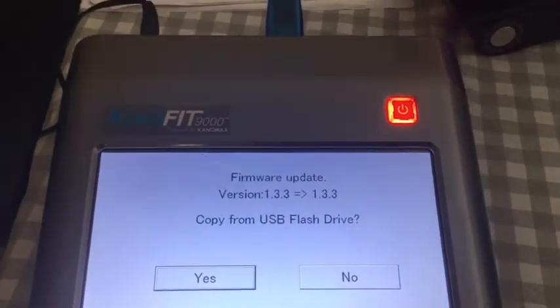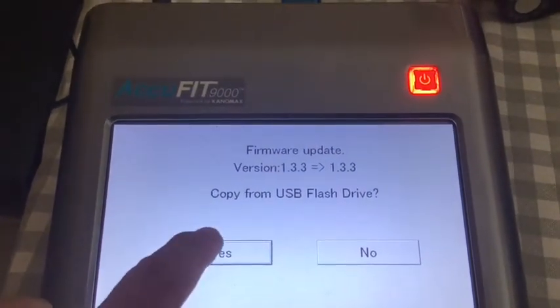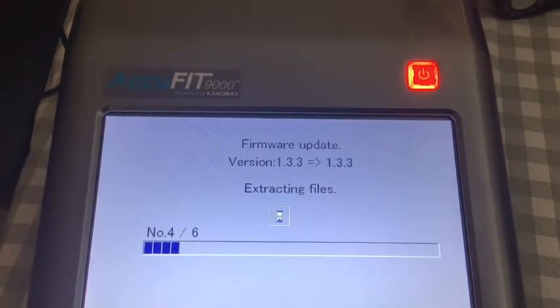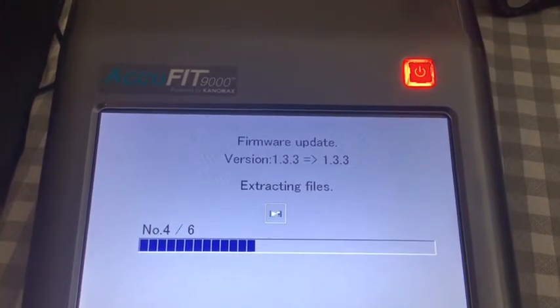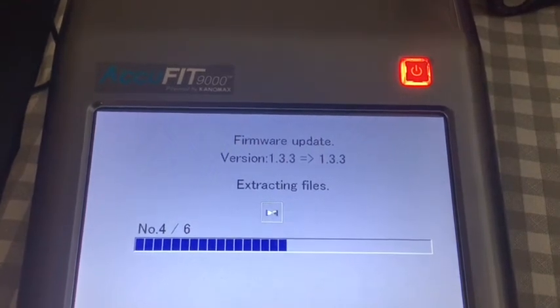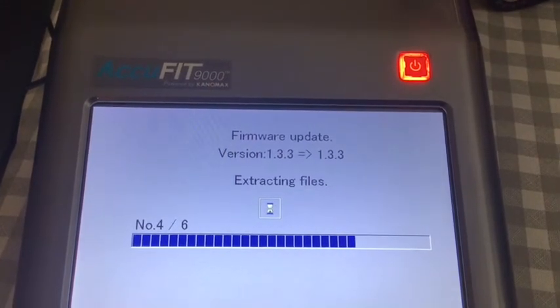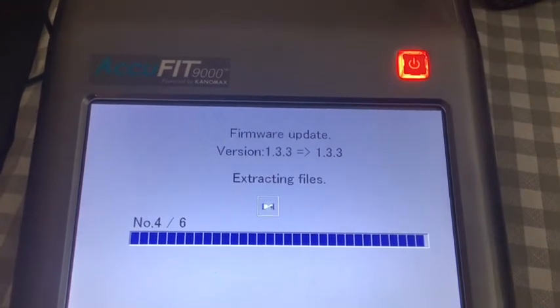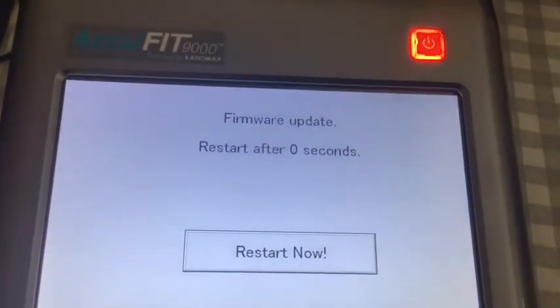I've already upgraded the firmware on this unit, so you can see it's showing that it's copying the same version over — but this is just to show you how it works. I hit yes, and it extracts the files. It's going to restart. I'll pull the flash drive out now and that's your upgrade done.